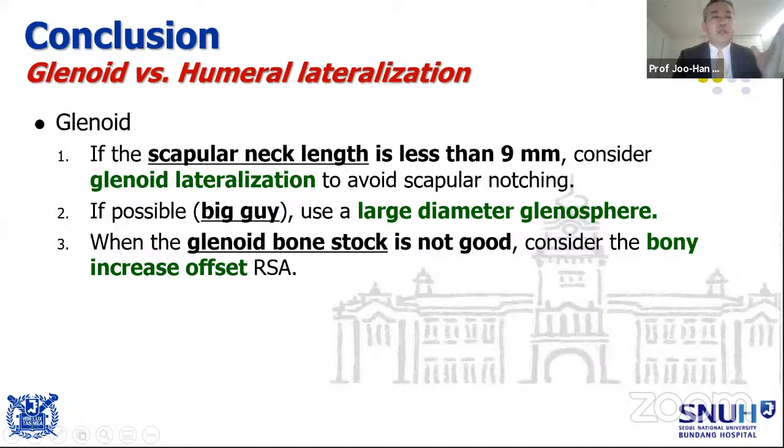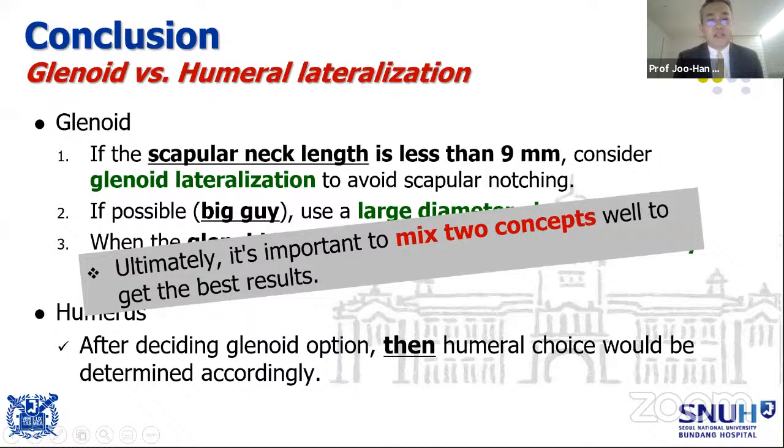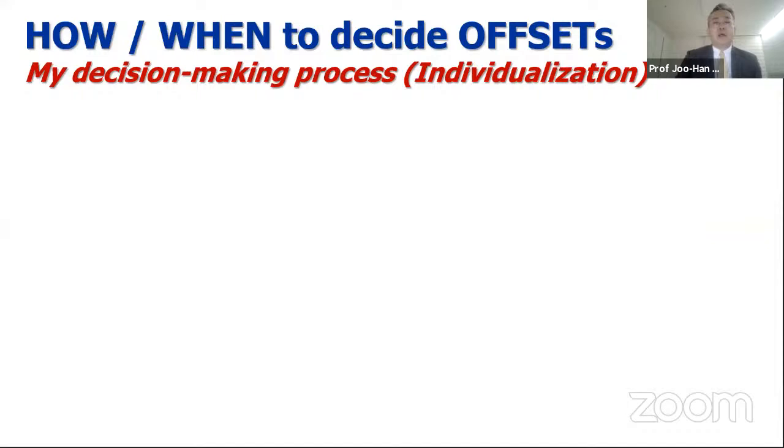At first, we had better think about the glenoid: scapular neck length, patient size, or bone defect of the glenoid. And then we can choose the humeral component according to the glenoid option. We can determine the humeral options accordingly. So ultimately, it is important to mix the two concepts well to get the best result. I will show my decision-making process of how I decide the offset.